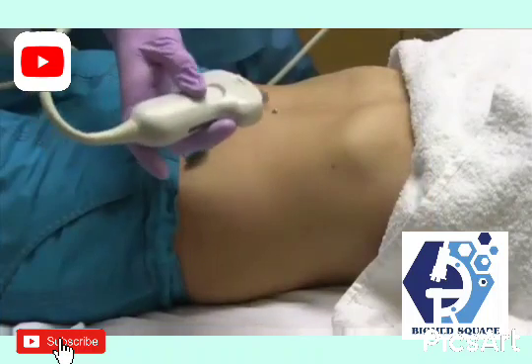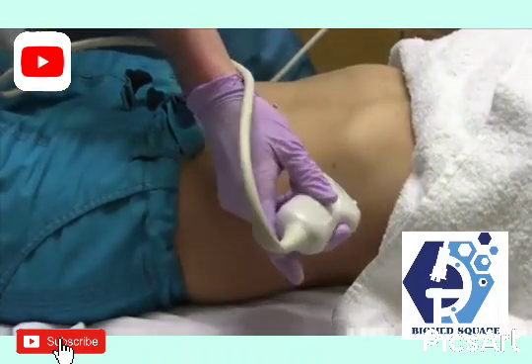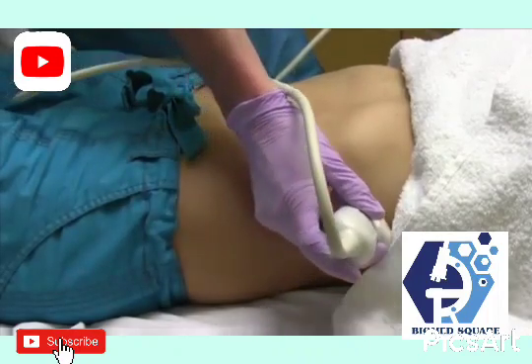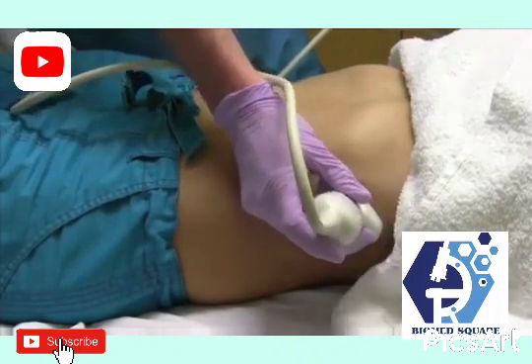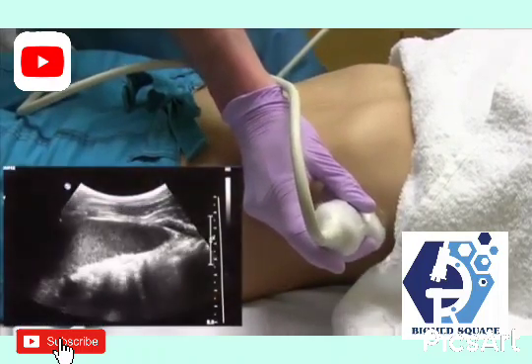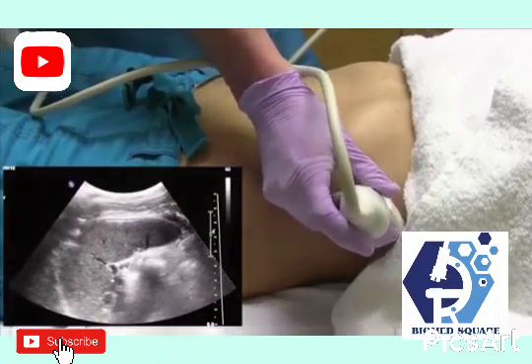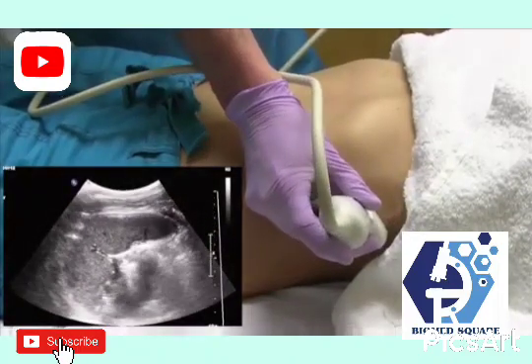So to image the spleen, you're going to come to the patient's left side, and again, you're going to want to make sure you're scanning right in this rib space here. So your probe is going to be slightly obliqued. And once you find that rib space, you'll feel the probe drop down into it.